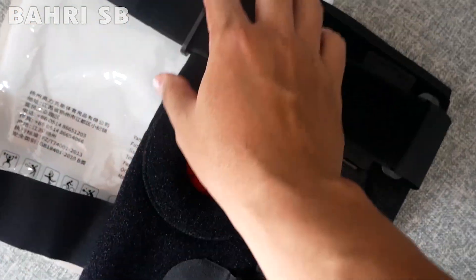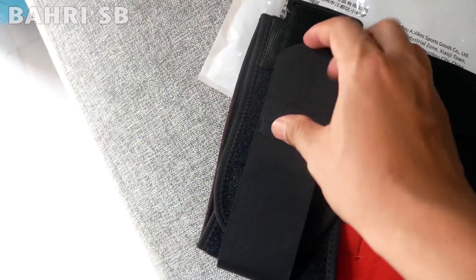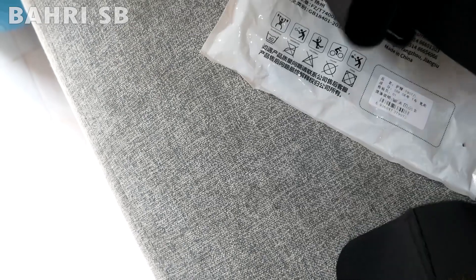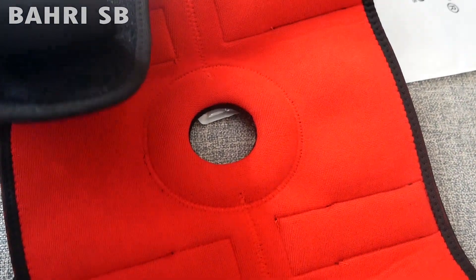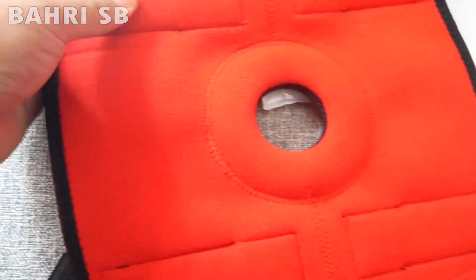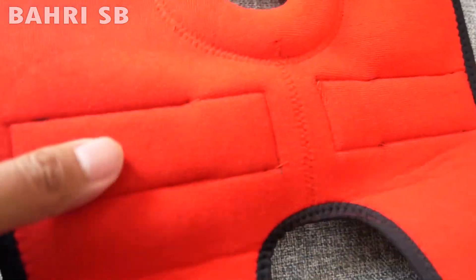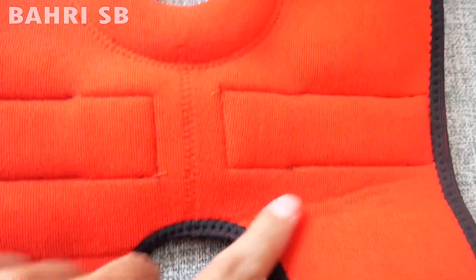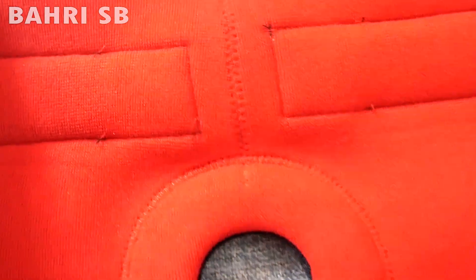Disini terdapat 4 strap, di bagian atas 2 dan di bagian bawah juga 2, totalnya 4 strap, jadi lebih rekat dan lebih kencang. Bagian dalamnya berwarna merah. Ini dia plat besinya yang tadi saya sebutkan untuk penyangga lutut agar tidak goyang-goyang, di tengahnya ada lubangnya untuk memberi kenyamanan pada saat dipakai untuk olahraga.